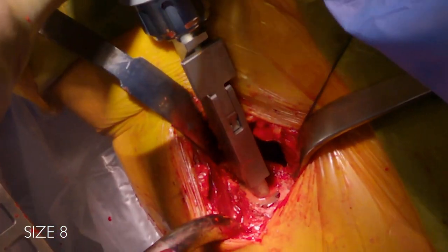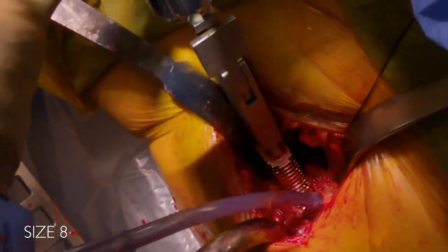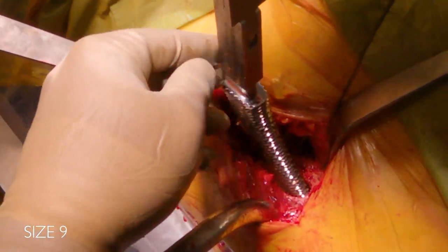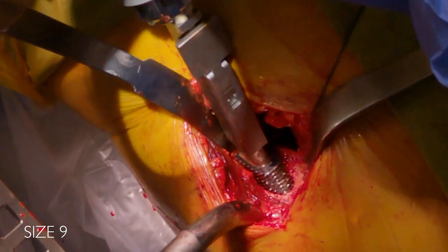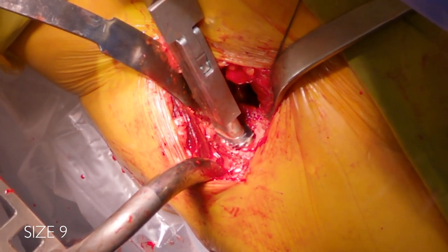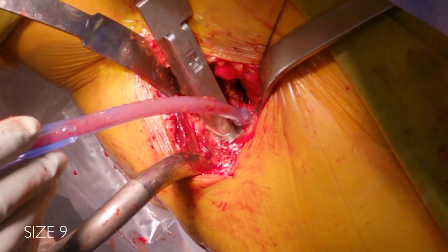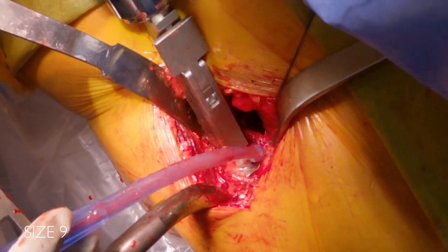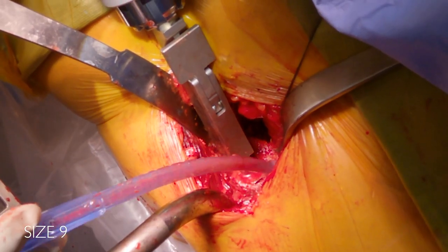I want to go up one more broach size, as I think I can get another broach in and still reach the level of my neck cut. Here's a size nine. I do find that I get a bigger size stem in than anticipated with the Concise — it efficiently makes the broach fill up the canal. No force needed; it's rotationally stable and filling the entire canal space at the level of the neck cut.